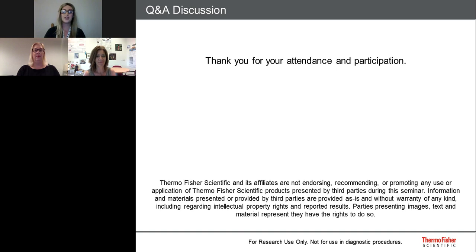Now, Dr. Kuzmana-Ozog, this one is for you. Do you perform CytoScan Dx and XON Array on all samples? Thanks for that question. No, we do not perform both Dx and XON on all samples. Some of the cases that I illustrated today, we did run both, in part to just demonstrate the differences between the two platforms.